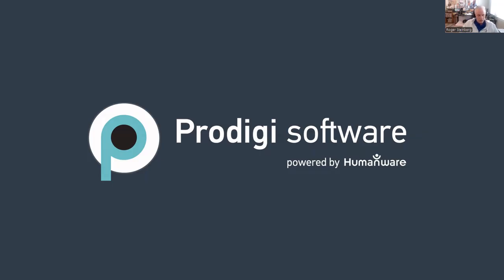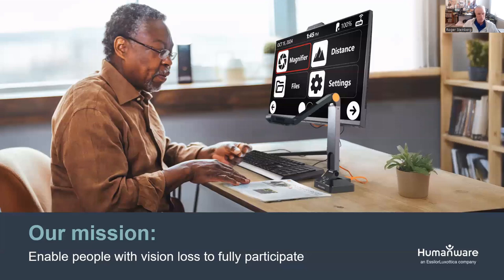So very quickly, just let me know if for any reason you're not seeing the screen. You should be seeing our mission statement right now, which is to enable people with vision loss to fully participate. And here you can see on the screen an older gentleman using our Prodigi software on a fairly large PC with a document camera and keyboard to interact with a newspaper that he's looking to read. And it's not just older folks that we want to use the software, but across the range of age groups.